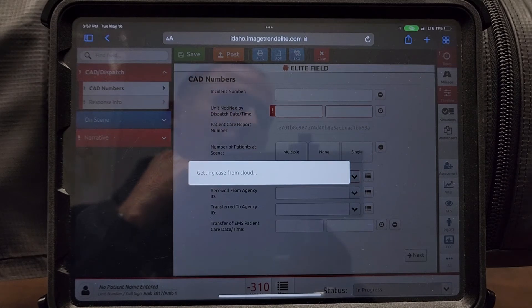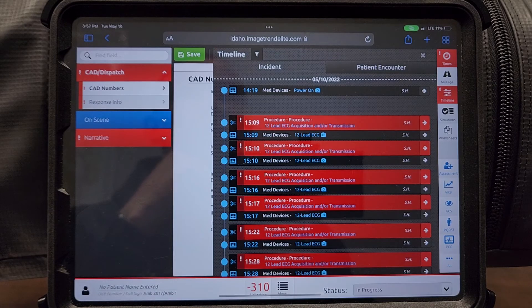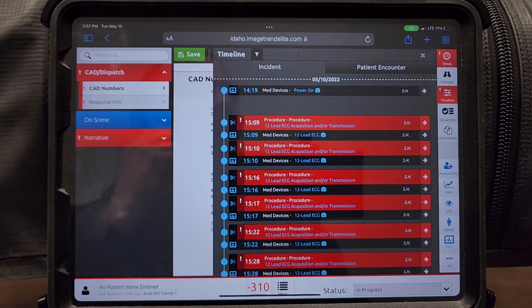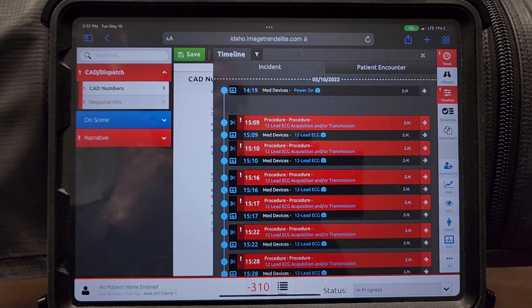After the download has been complete and you go to your vital sign tab, you'll notice that your vital signs have been uploaded. Also, any 12-leads or snapshots will be uploaded as well.